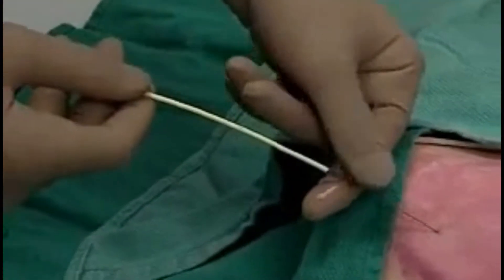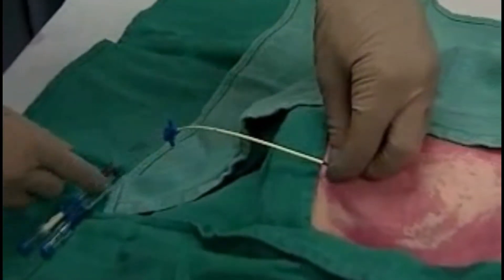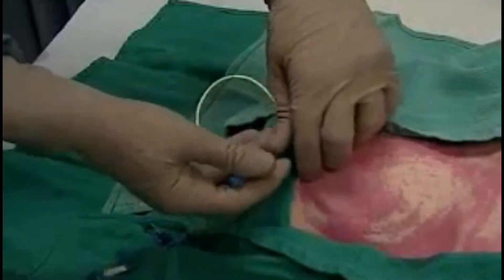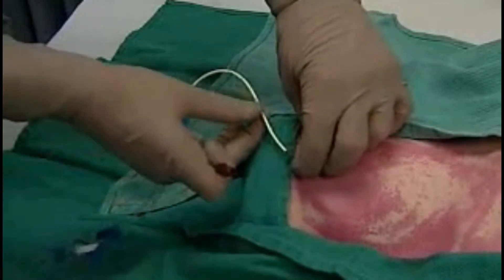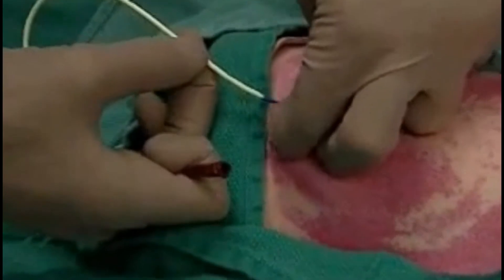Now we advance the central line catheter over the wire, partly withdrawing the wire if necessary, until the wire is seen at the catheter hub. Uncapping that hub, we'll advance the wire backwards till it exits the port.